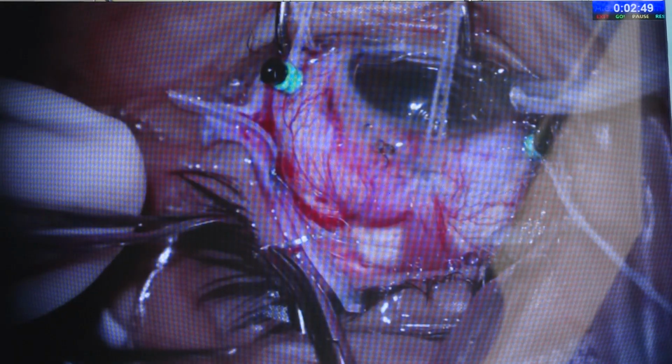So we have passed an encircling element to provide support to the vitreous base, and this is the area of incarceration. We are removing as much pre-retinal fibrous tissue as possible, but it is not always possible if there is a long delay. Then we are diathermizing, and using the cutter this time to create the retinotomy around the incarceration site. Here scissors are used to cut the fibrous tissue between the entry and exit wound. You diathermize and achieve hemostasis, and then do a fluid air exchange.